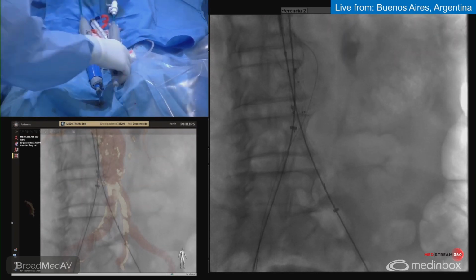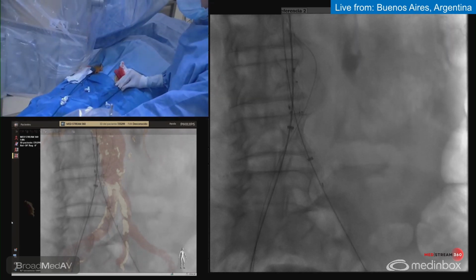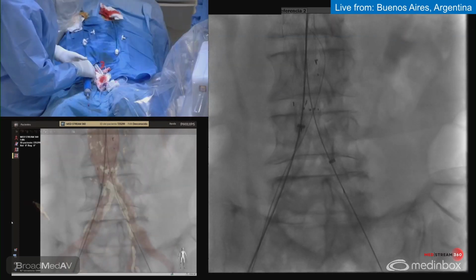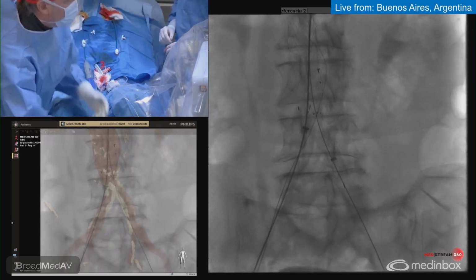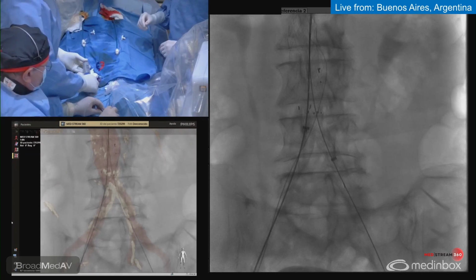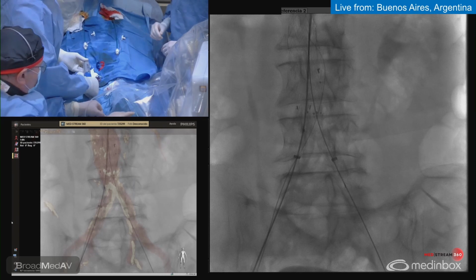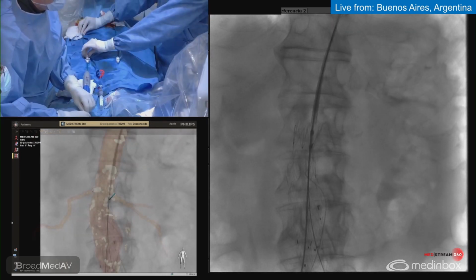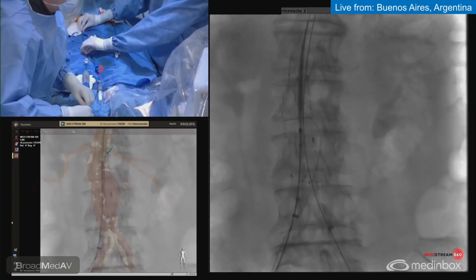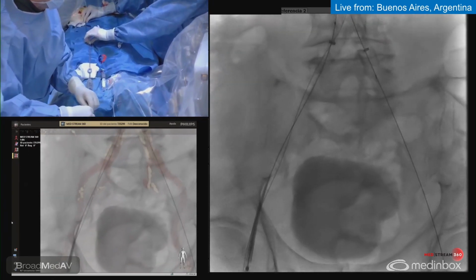Okay, everything is open. I'm going to advance the sheath. Now I have to disconnect here very smoothly. Okay, now I'm going to continue releasing the main body. Actually, the homolateral branch. Keep rotating. I'm going to release the homolateral branch, and it's totally free. Let's see, being very careful that the delivery system is coming in. Perfect. One is holding the sheath inside.